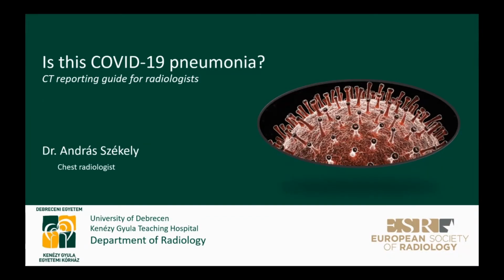The goal of this presentation is to help you in situations when you encounter a patient or you see CT morphology that is suspicious for COVID-19 pneumonia. I do hope that you will never need to use what you will have learned today. Nevertheless, this presentation will be available for you anytime.